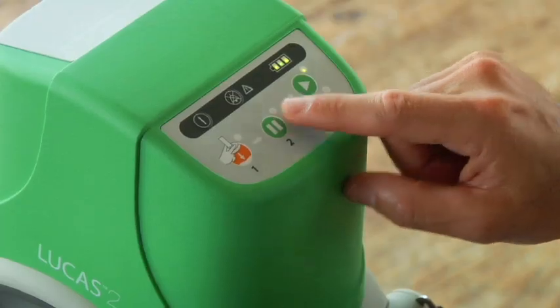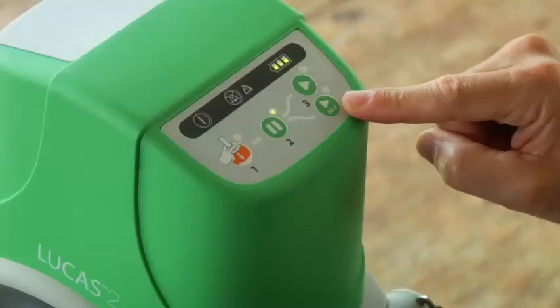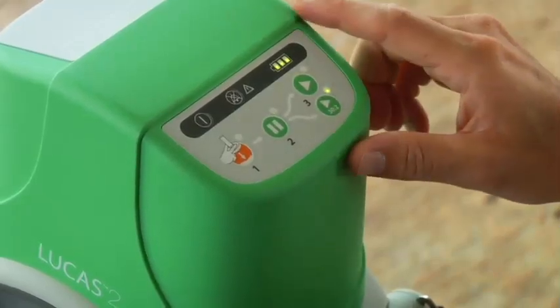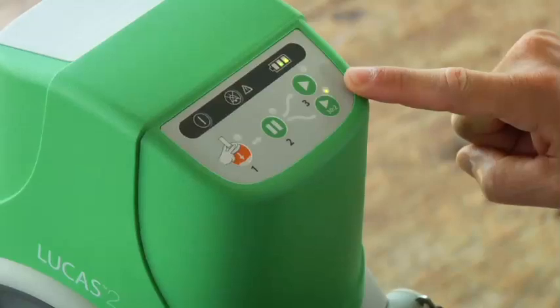This LED prompts you for ventilations eight times a minute. While Lucas is operating, the pause button pauses compressions with the suction cup up at the start position you set. Active 30 to 2 does 30 compressions, then pauses three seconds so you can give two ventilations. There's an LED to prompt you and also an audio signal that alerts you just before each pause.